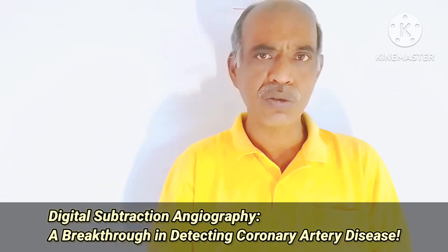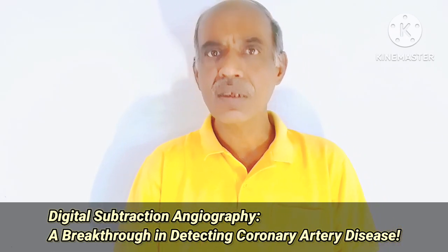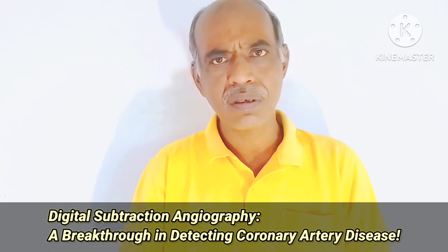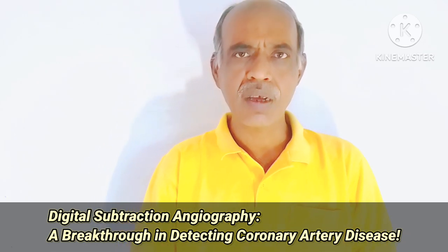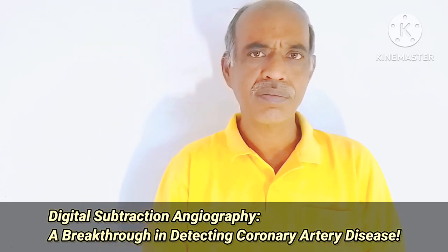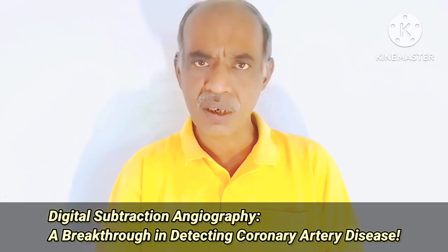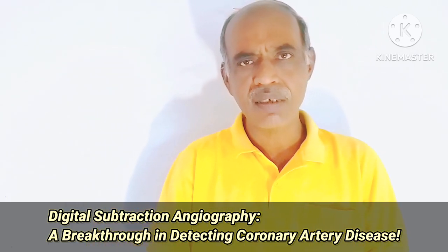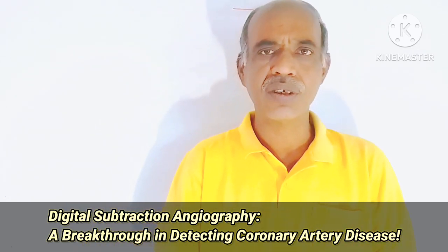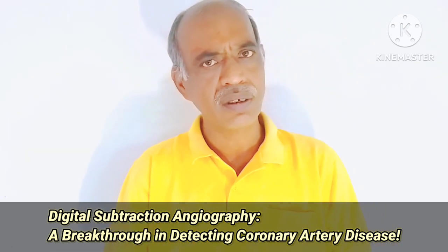Again, contrast dye is used. That is one more risk factor, a kind of disadvantage. Contrast dye is not well suited for all patients. A few people may experience allergic reactions due to this contrast dye. They may even experience kidney complications. Though in digital subtraction angiography, a lower level of contrast dye is injected. That is an advantage. So advantages and disadvantages are both present simultaneously.